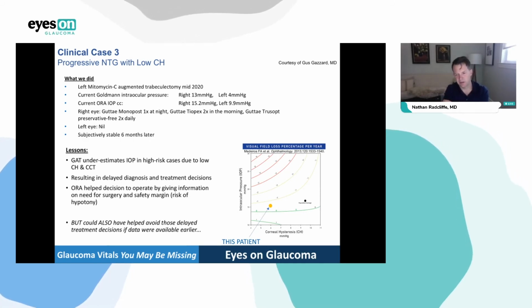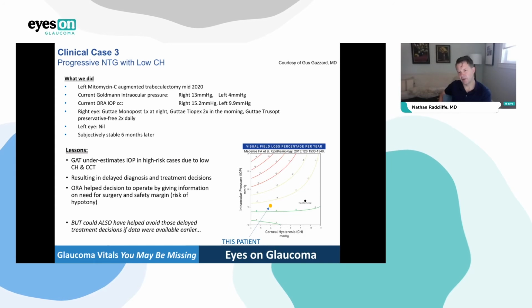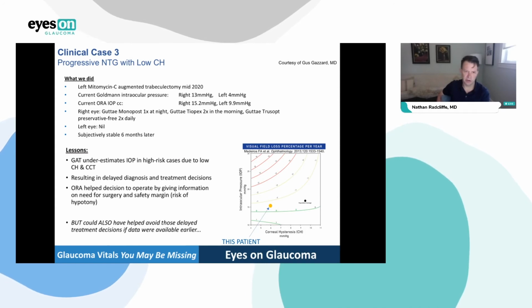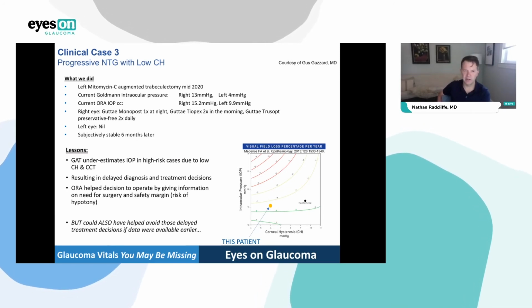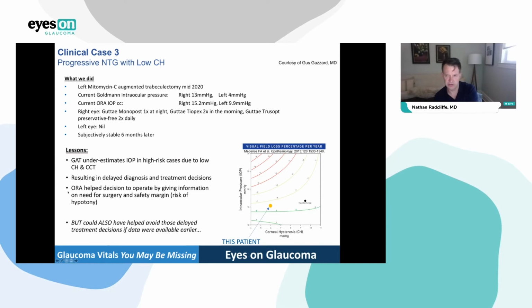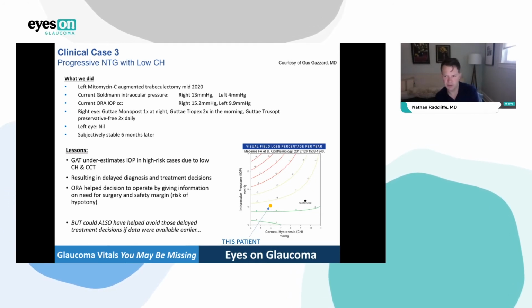So, it's a really good example, again, of how low hysteresis was sort of a red flag. I think one of the lessons here might be, if you had hysteresis early on, you could have treated and possibly avoided surgery. And we always Monday morning quarterback, but there are lots of us who got the ocular response analyzer halfway through the clinical course of a patient and felt like, wow, I finally understand you. The reason that you've been slipping away on me is because despite these good pressures, your hysteresis is so low. And now I know I am going to add that other medicine. I am going to do that laser. It can kind of help you feel more confident to be more aggressive.